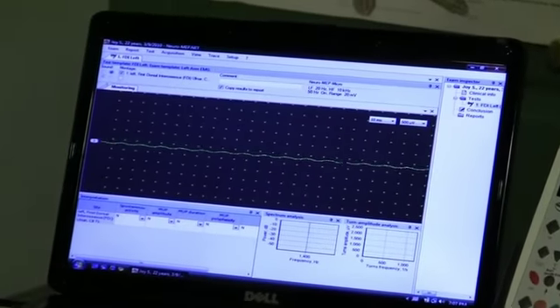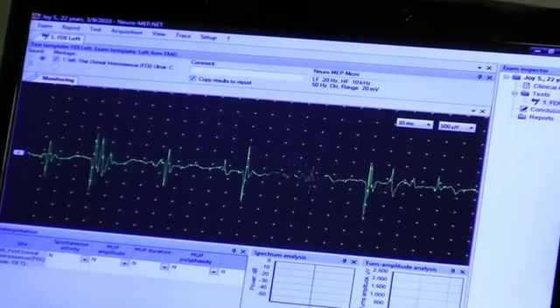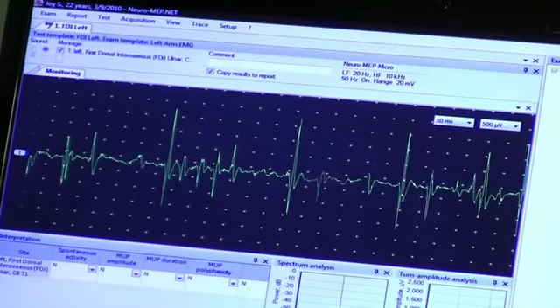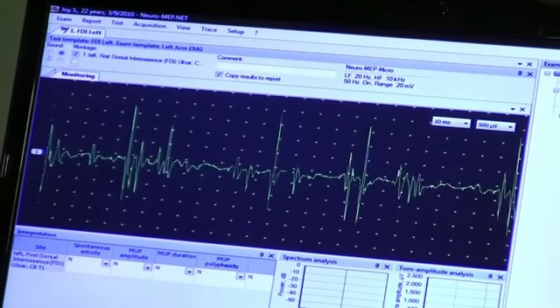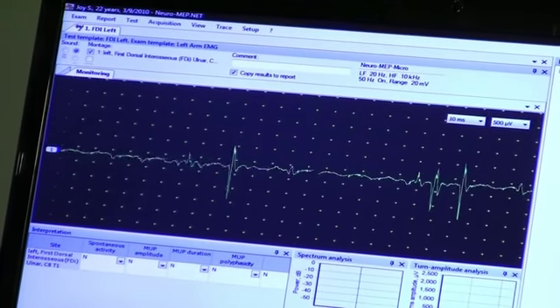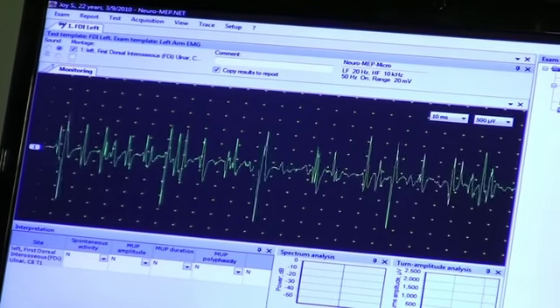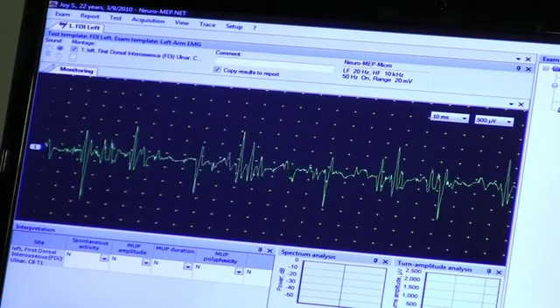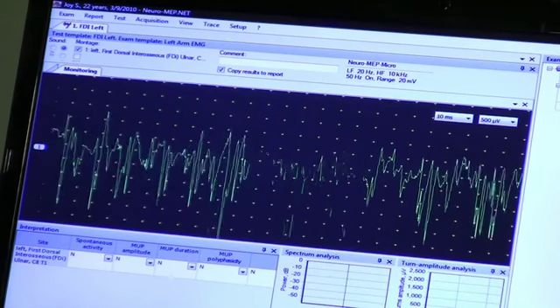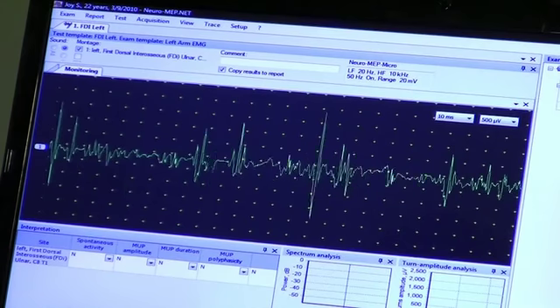Now raise your finger up to the ceiling. Now these are the motor units. They are normal motor units. The muscle is firing normally. And this is at moderate activation. Raise it a bit less, a bit less. Now I see 1 or 2 here, 3. Raise it some more. Okay. And now raise it up all the way. And now this is called full interference pattern. That means that the muscle is fully activated.